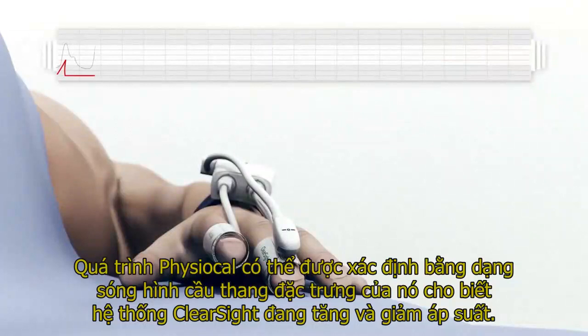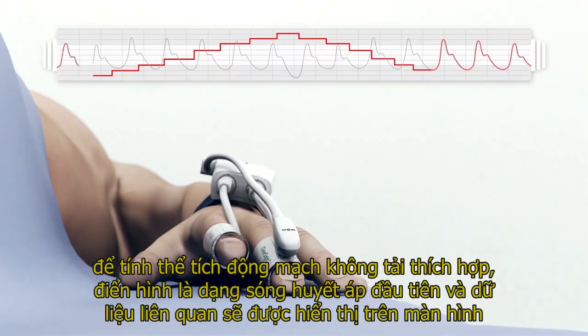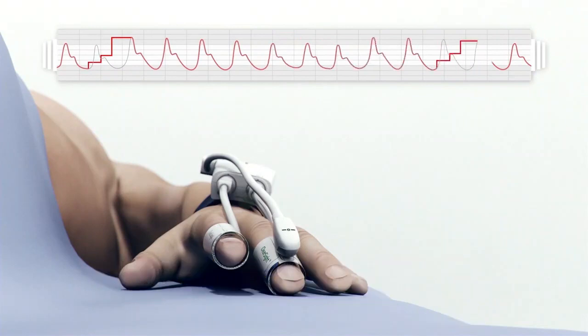The PhysioCal process can be identified by its characteristic staircase-shaped waveform, which indicates the ClearSight system is stepping up and down in pressure in order to calculate the proper unloaded arterial volume. Typically, the first blood pressure waveform and its associated data will be displayed on the monitor in approximately 20 seconds.